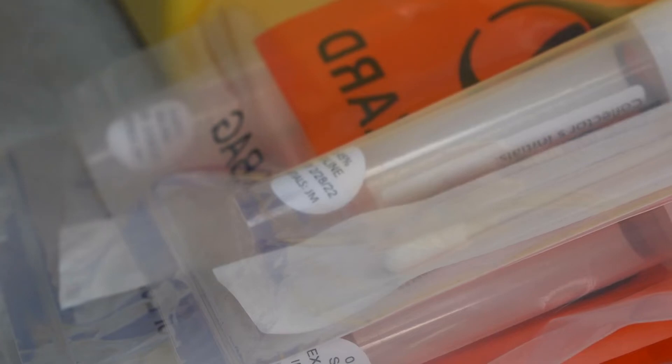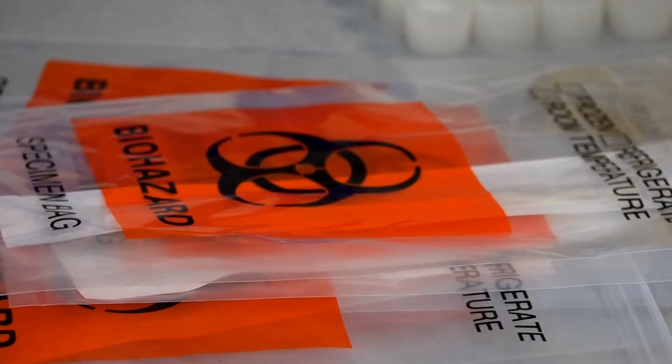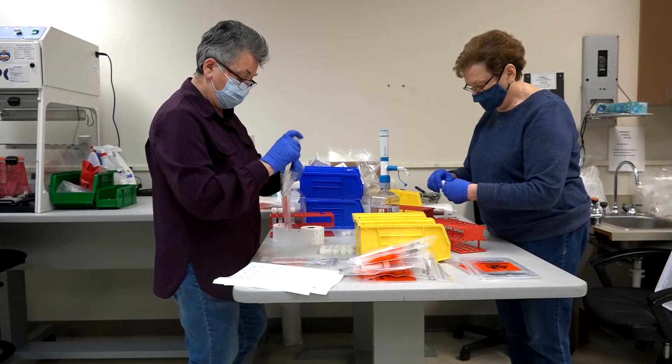When you take a COVID-19 test, the studying actually happens here. They start processing it on our analyzers for the actual diagnosis.